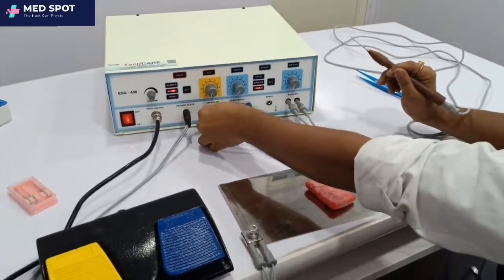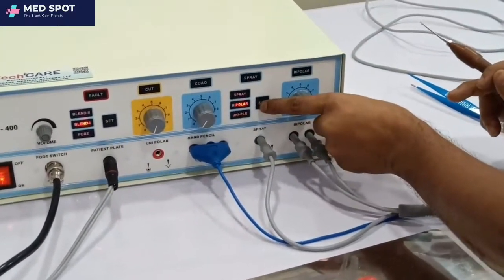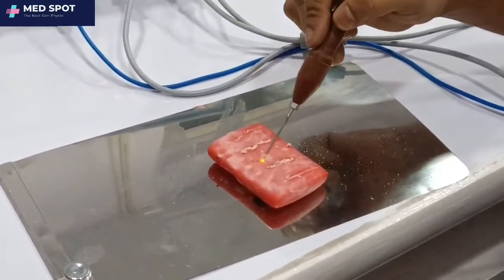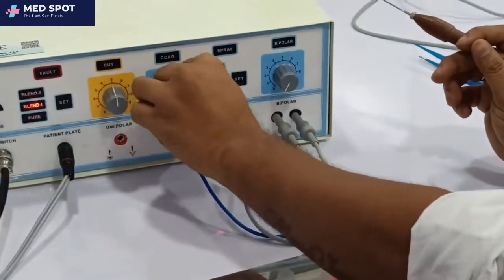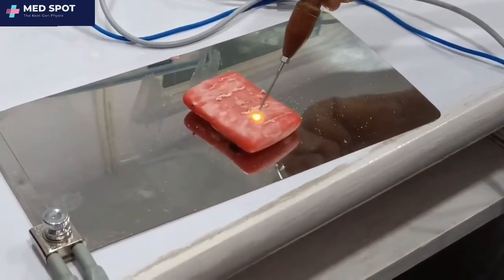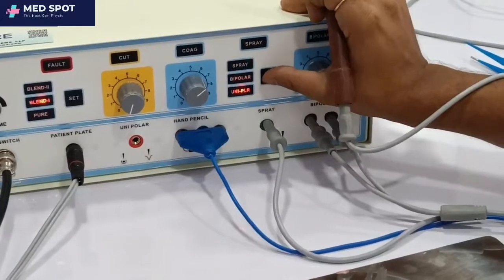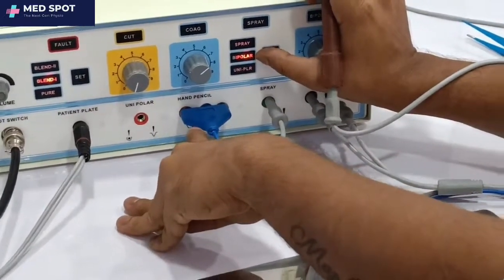Now we are using the spray. First, you need to switch the connector from the unipolar port to the spray port, then press the spray button. Then you can use coag through the spray. Now to switch to bipolar, press the bipolar button — we were using it in unipolar, now it is in bipolar mode.